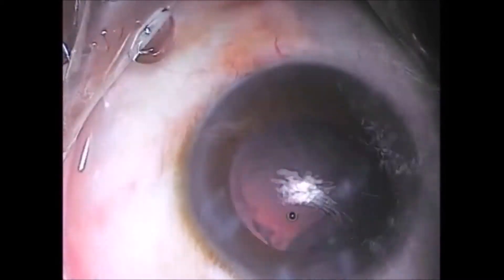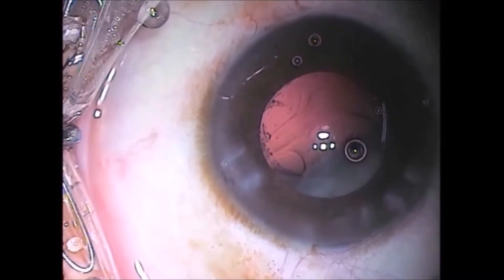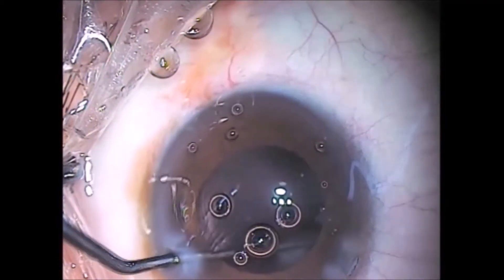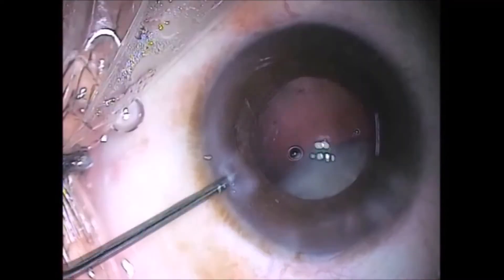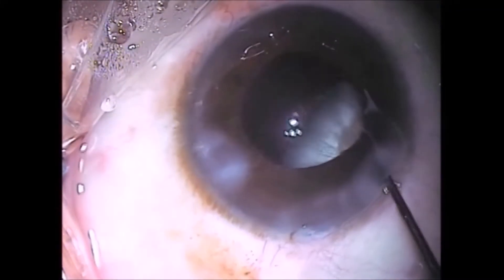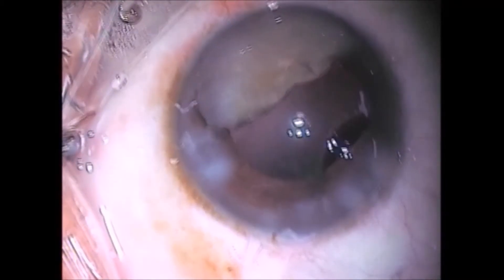Where is the other half? Some more viscoelastic is injected as the posterior capsule is clean without any folds. Most probably the other hemi-nucleus got stuck in the zonules after piercing the equatorial capsule. As soon as viscoelastic is put in, it disappears and reappears again. Finally, it is retrieved with a Sinskey hook and brought into the anterior chamber. A copious amount of viscoelastic is injected to block the equatorial rent in the capsule.